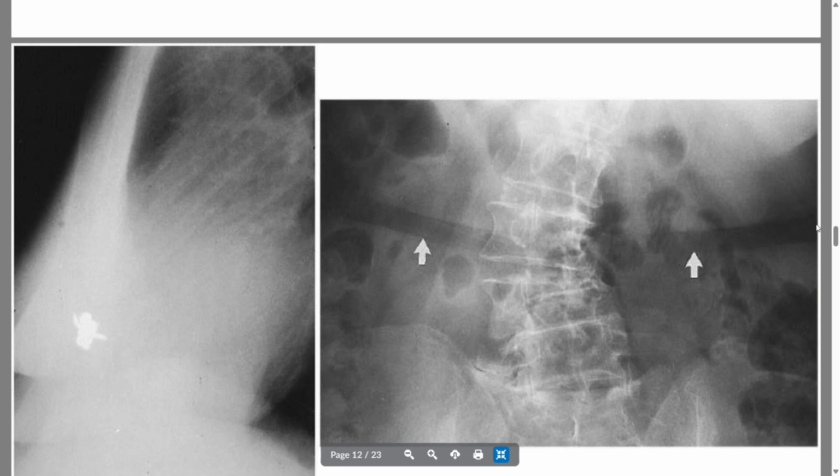You'll see this really, really often, especially in larger patients. This is typical of the space in between fat folds. You'll see this radiolucent banding, really common patient artifacting that can occur. This can also occur if you're wearing really tight clothing with an elastic band. So if somebody was wearing yoga pants high, sometimes it'll cause a pseudo rolling effect and cause that separation. So if you ever see that, that's what that is referring to.